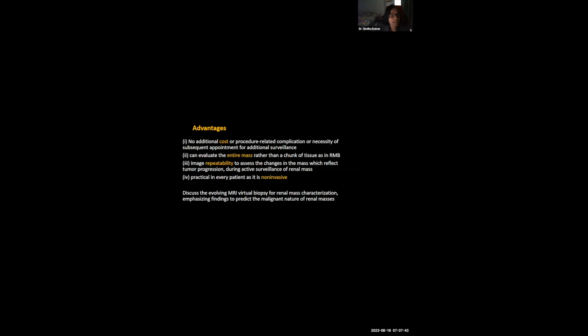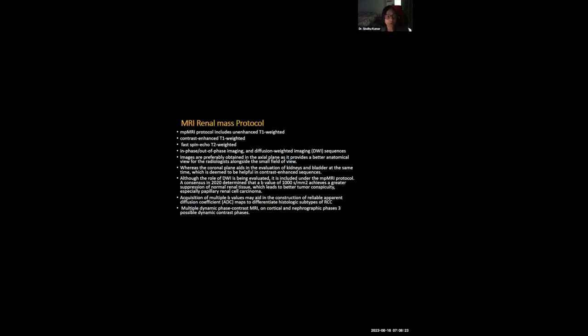So now, discussing the evolving MRI virtual biopsy for renal masses using multiparametric MRI renal protocols. MRI is a good substitute for renal mass biopsies, and it acts as a virtual biopsy tool for non-invasive tumor diagnosis based upon imaging characteristics. Multiparametric MRI involves construction of a standardized algorithm to evaluate your renal mass. It predicts the histology of renal masses with an accuracy, sensitivity, and specificity of up to 98%, 85%, and 98% respectively. So the MRI renal mass protocol utilized in our institution is as follows.